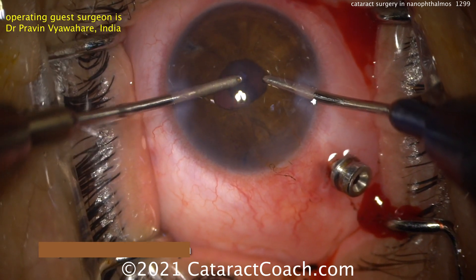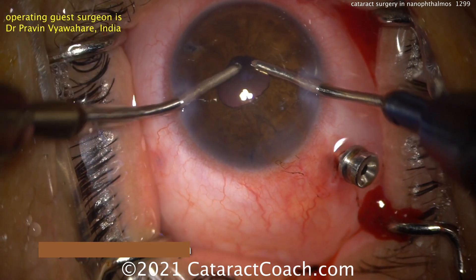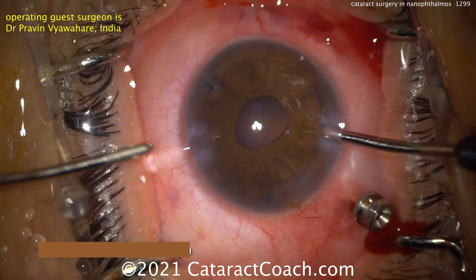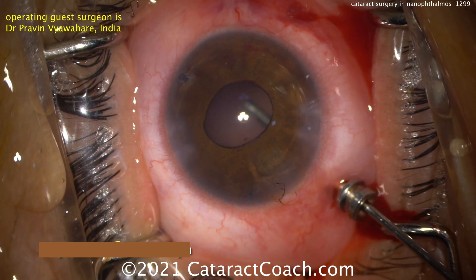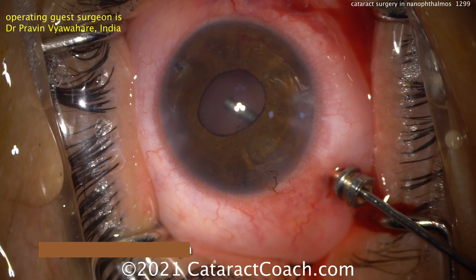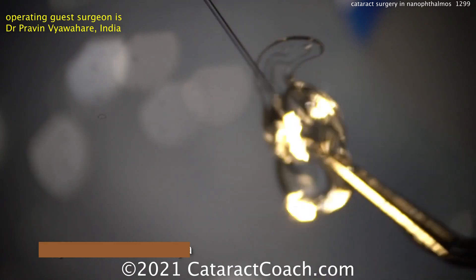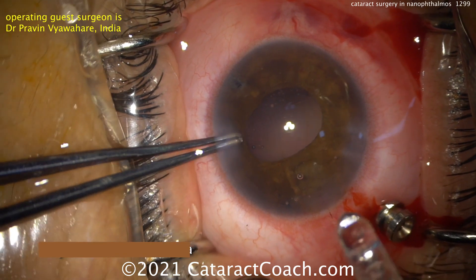The trocar is staying in and he's completing the cortex. This is a very stressful case — obviously the video is edited; this case is going to take a lot of time, and that's okay. When doing these patients, explain the difficult nature of their case. Now in the U.S. we don't have a readily available 63 diopter lens. The highest FDA-approved lens is a 40 diopter — the Alcon SA60 series. If you calculated that the patient needed a 63D lens in the USA, just put in the max you've got, which is the 40, and go from there. This patient isn't expecting a perfect outcome.